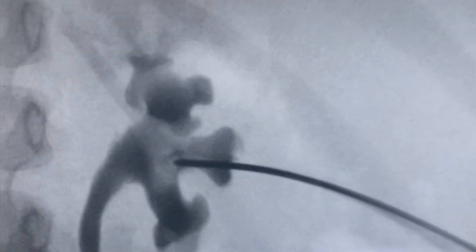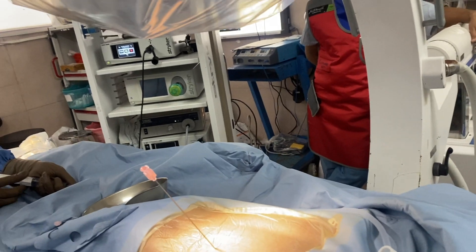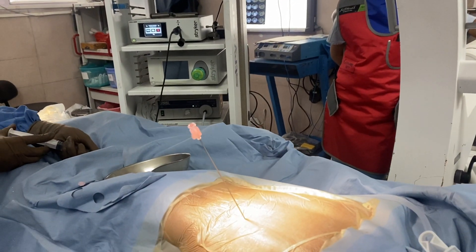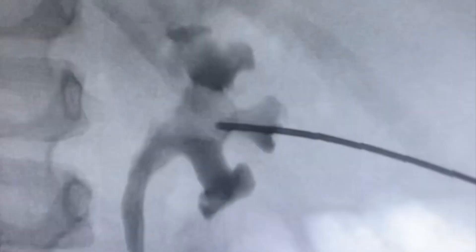You can see the needle tip is located at the tip of the calyx. I am rotating the C-arm to 30 degrees and slightly guiding my needle into the kidney. Now you can see it has been punctured. Once the needle enters the pelvicalyceal system, reconfirm your position by removing the stylet — you can see free flow of saline, confirming correct placement.